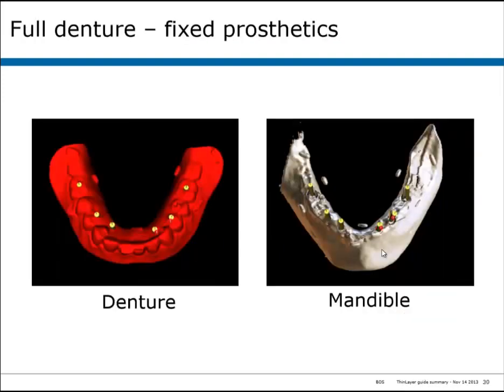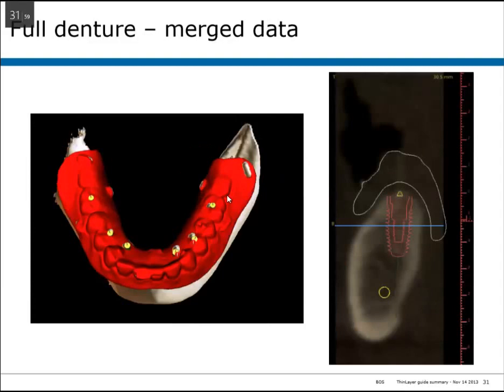In the next case, the dual scan method was used, where fiducial markers were placed on a denture. The patient was scanned wearing the denture, and then the denture alone was scanned. The two data sets were merged so that in the cross-sectional view, you get the alveolus and an outline of the denture. You can see the occlusal surface of the denture tooth, and the position of the implant in the center of that molar — the center line of the implant coming right up through the molar — achieving ideal implant placement.